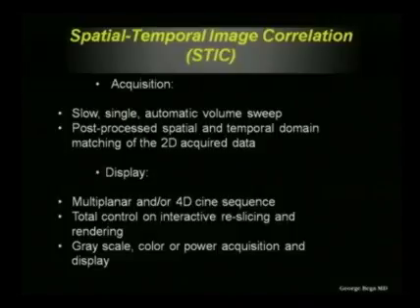The reason for that is the slower the acquisition, the higher the number of 2D slices acquired, but obviously also the higher the exposure time for this kid to move. So this is really a trade-off. STIC acquisitions are not easy, especially when we have an overactive fetus. The data are displayed in a standard multiplanar display or in rendered displays, and then the user can interactively re-evaluate and re-slice these image planes to the desired position.